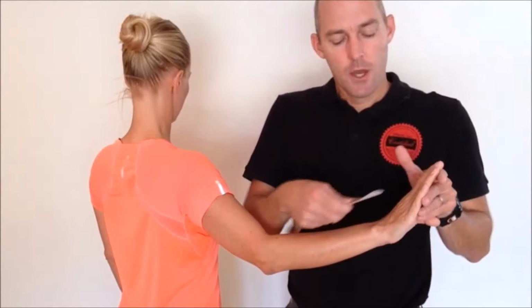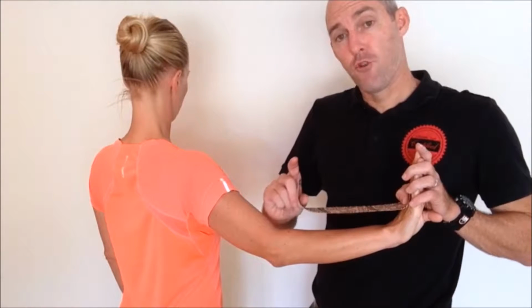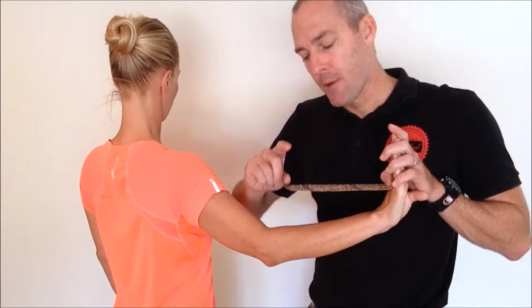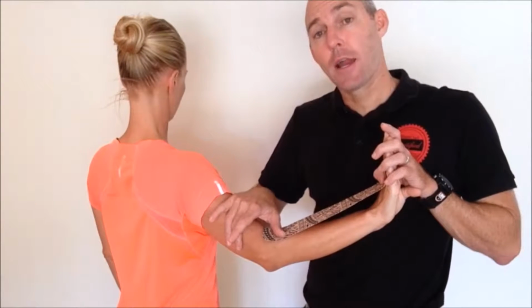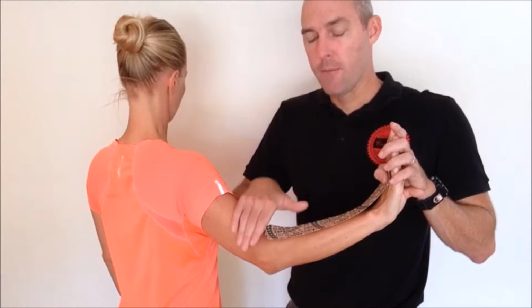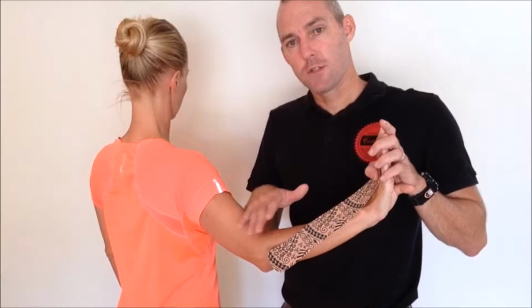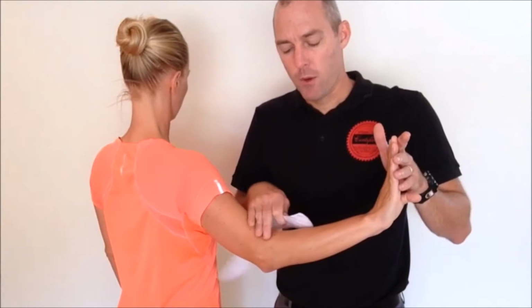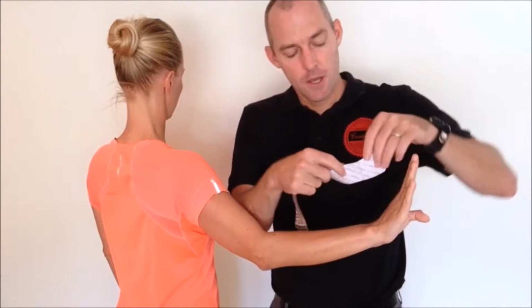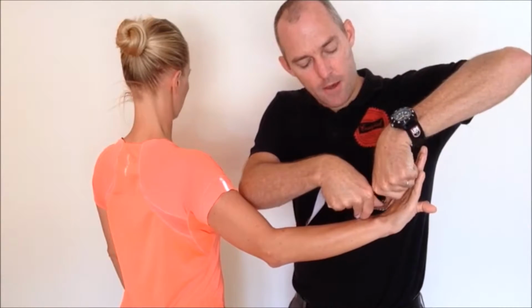So what we would do is we would apply one end, we would once again peel the backing sheet off to our proximal anchor, take up the slack along the whole piece of tape, apply that down, and then apply our anchor at the end with absolutely no tension on it once again. So that way we really make sure we have no tension on our anchors, but we have nice uniform tension along the rest of the piece of tape. Now for something where we were trying to do the wrist and finger extensors, we generally split this and run off the fingers. But for this purpose, for demonstrations here, we'll just come off the back of the hand.